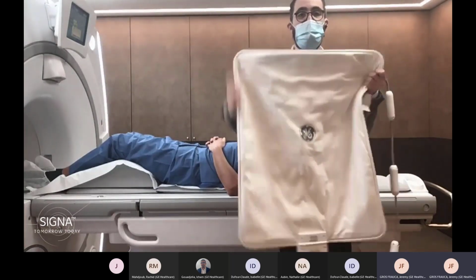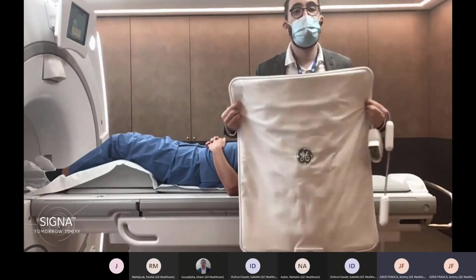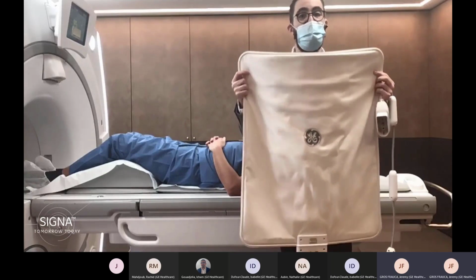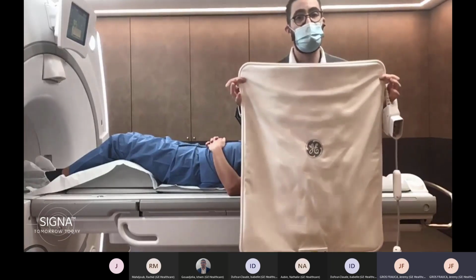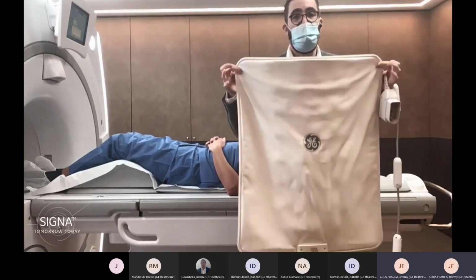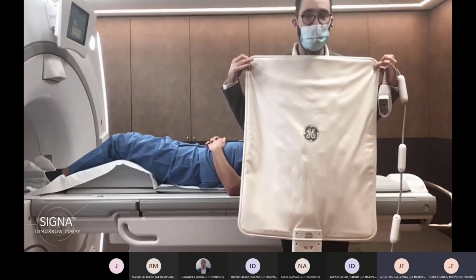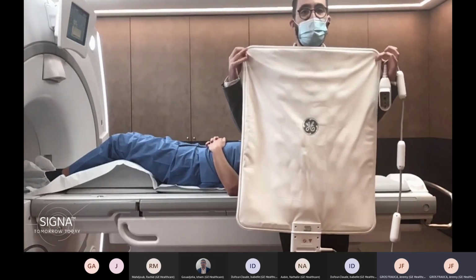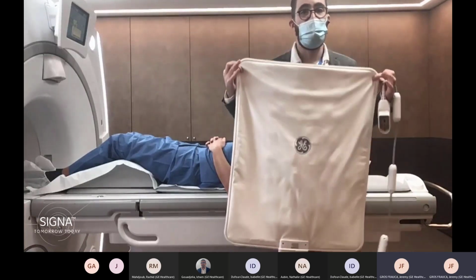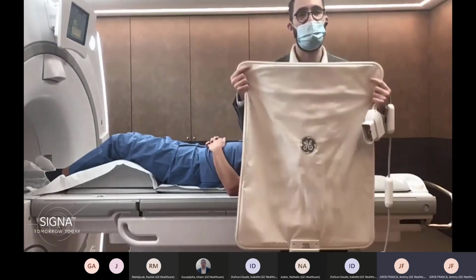As well, this coil is really flexible. You can wrap it as you want, and so you can adapt the coil to your patient's morphology, which is really critical in terms of image quality. So you can fit larger patients and, in the meantime, also smaller patients like pediatric patients. And we are talking about body imaging, so you can see the coverage. You have an amazing coverage, which gives you the possibility to scan thorax, abdomen, or pelvis without moving the coil, which is pretty important.